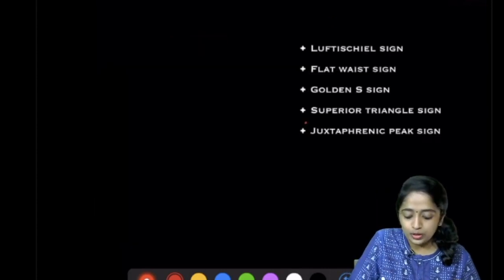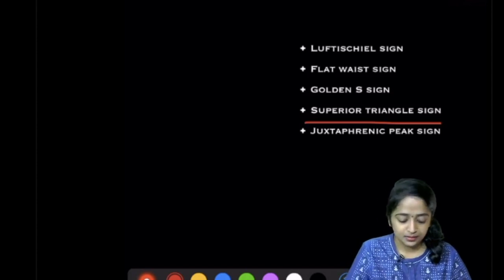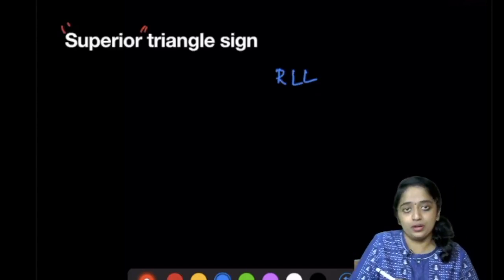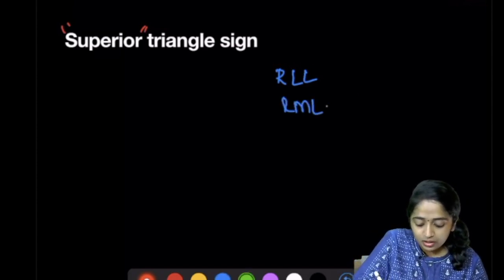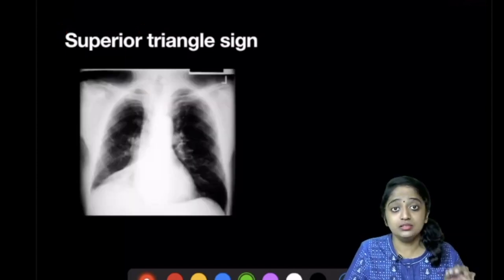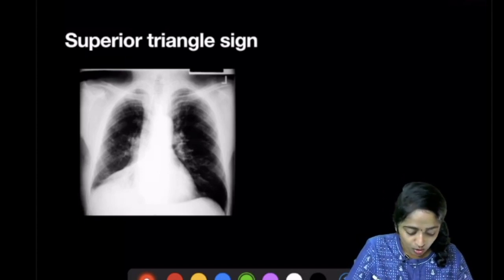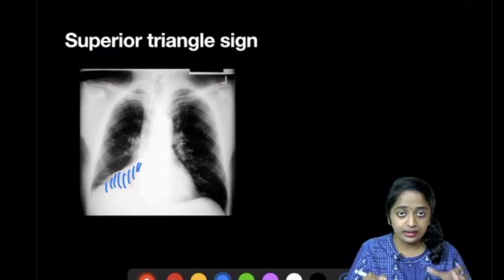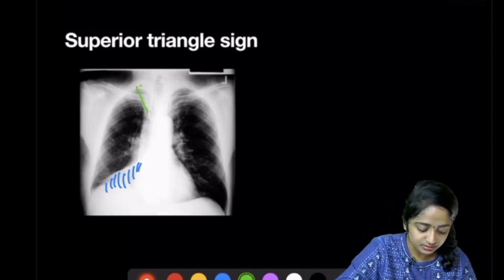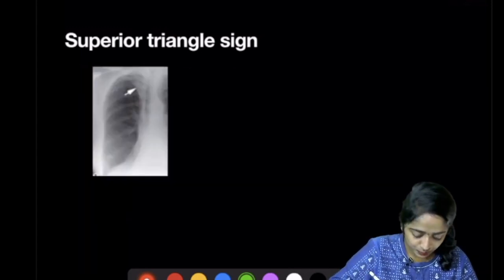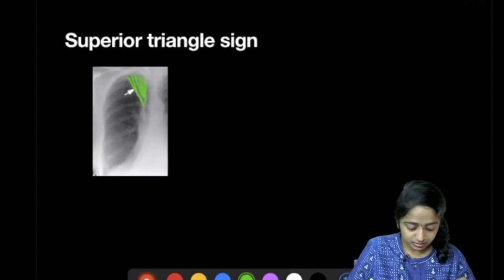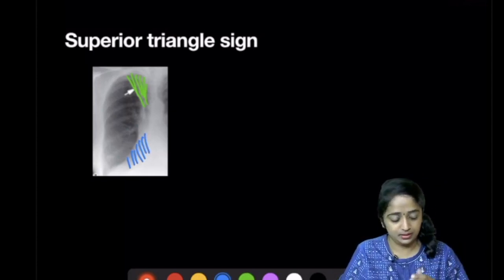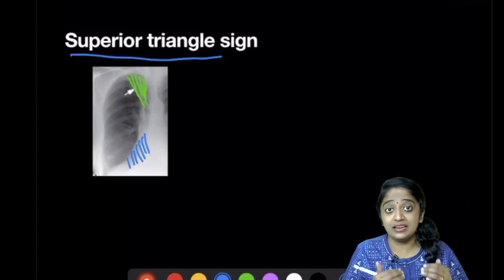Moving to the superior triangle sign — do not confuse this with other 'superior' signs. This sign is classically seen in right lower lobe collapse, or right middle lobe with right lower lobe collapse. In this typical picture of right lower lobe collapse, there is a triangular opacity with volume loss. Notably, you can also see a triangular density in the right upper lung zone — this is the superior triangle sign, an ancillary finding in right lower lobe collapse.